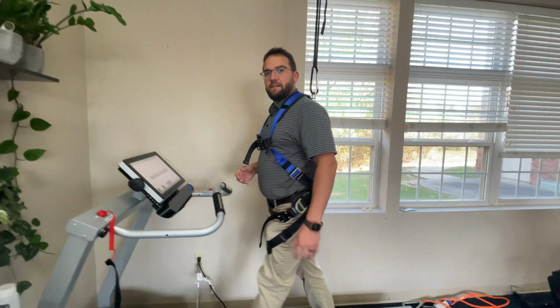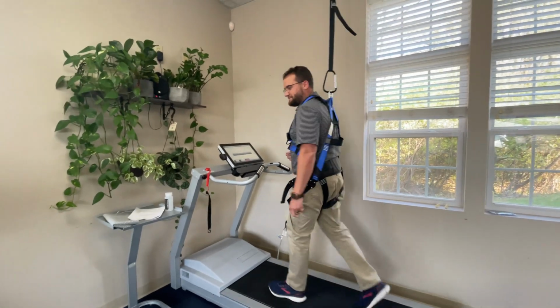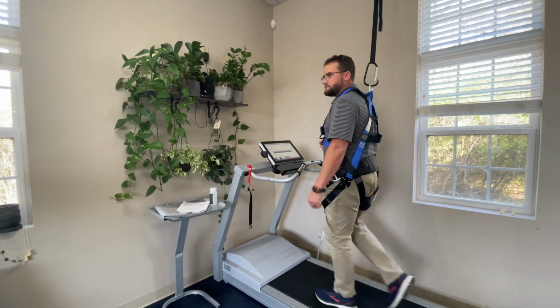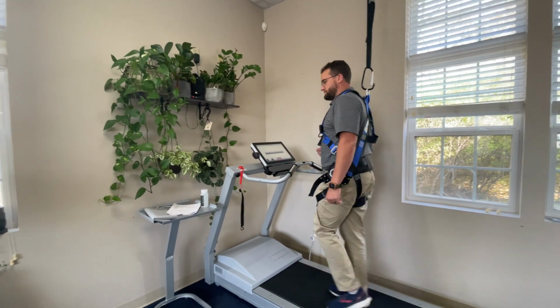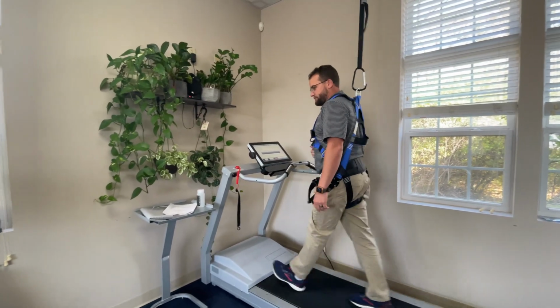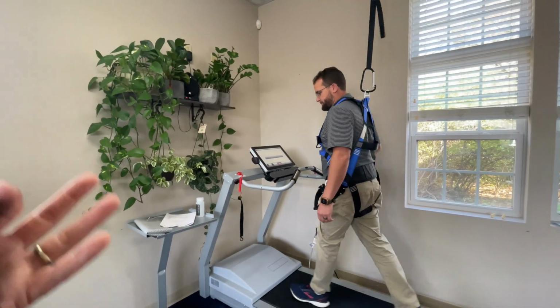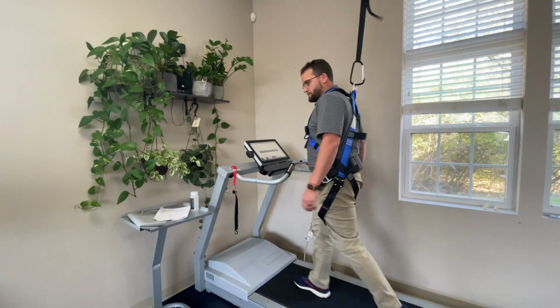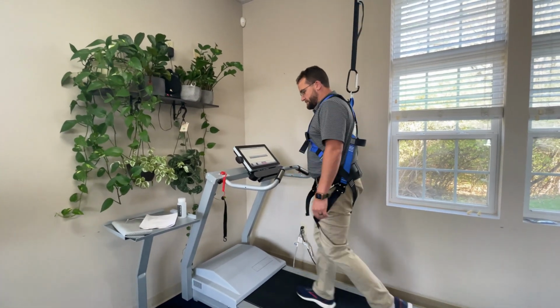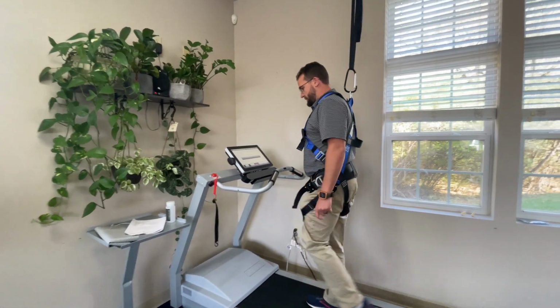I think a lot of the benefit from this is just everybody's going to walk different. There is no perfect walking pattern. There is no perfect posture. Your best posture is your next posture. We've all heard that, and it's true. What this allows me as the therapist to do is to get a baseline assessment of what is normal for you. And then based on the pathology and the complaints that you're experiencing, we can start to tweak what's normal to maybe try to improve or reduce symptoms or pathology or something that's going on.